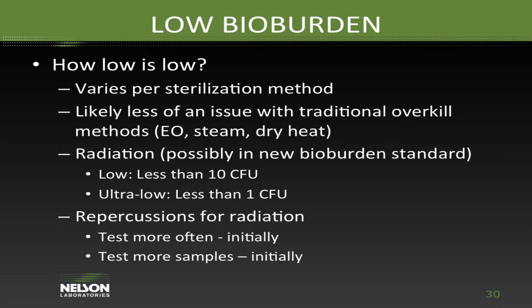As you know, there is no bioburden value at which you pass. There's no pass-fail for bioburden testing in most situations. The sterilization method does help to dictate what you would consider low. In a bioburden-based method like radiation, low might be one thing. In an overkill type method like EO or steam, then low will mean something very different.